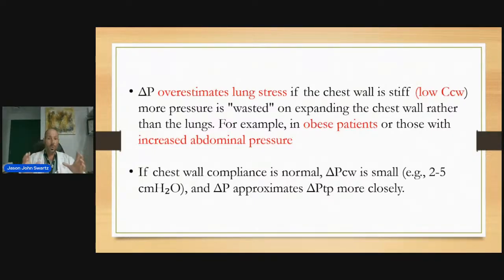You should look early on in that patient's intubation at the distribution of ventilation, and if this patient needs a PEEP of 16 to keep his big belly from squishing down the lungs, and he's on 25%, so be it. It's just basic physics. That's exactly what we have. We have a gentleman with a very large, firm stomach, and we use the electrical impedance tomography, and his optimal PEEP is 16.